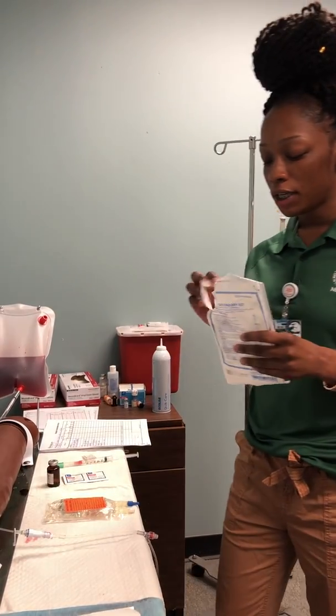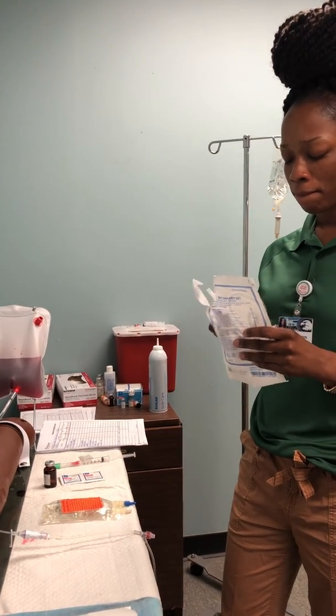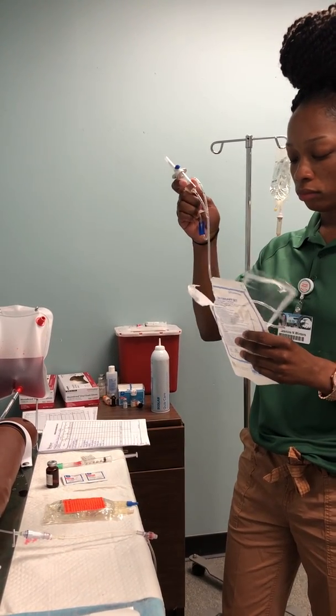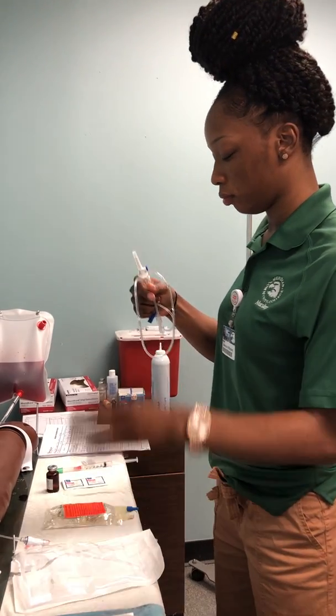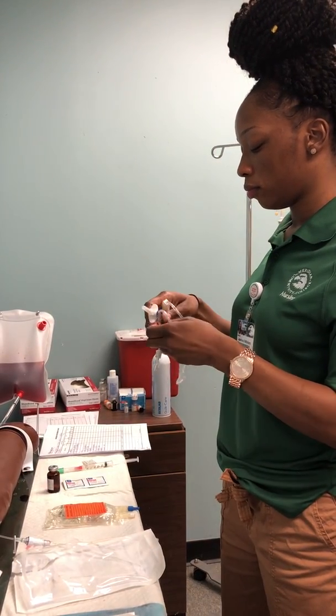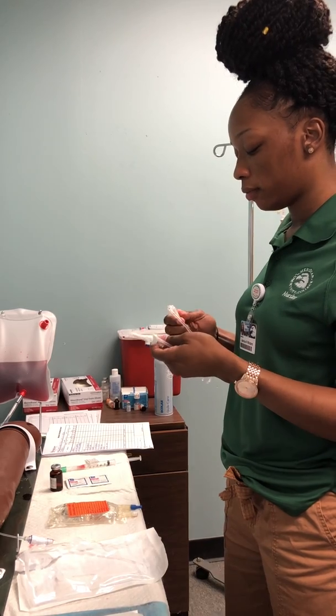And I'm going to open my secondary tubing. Click it off.